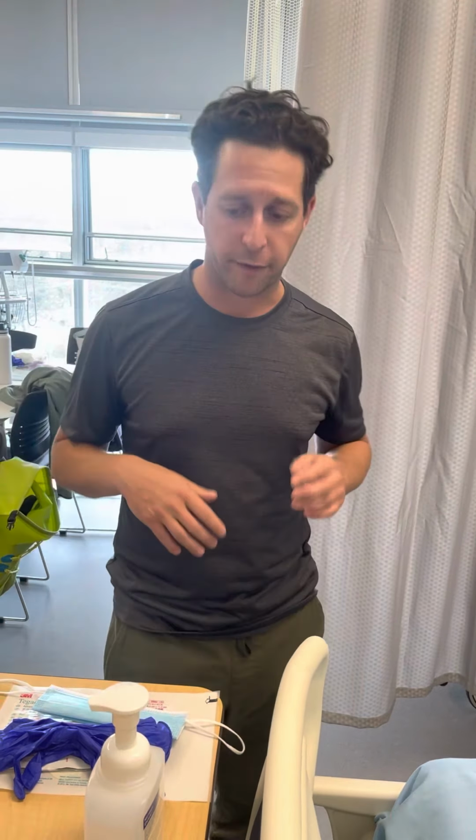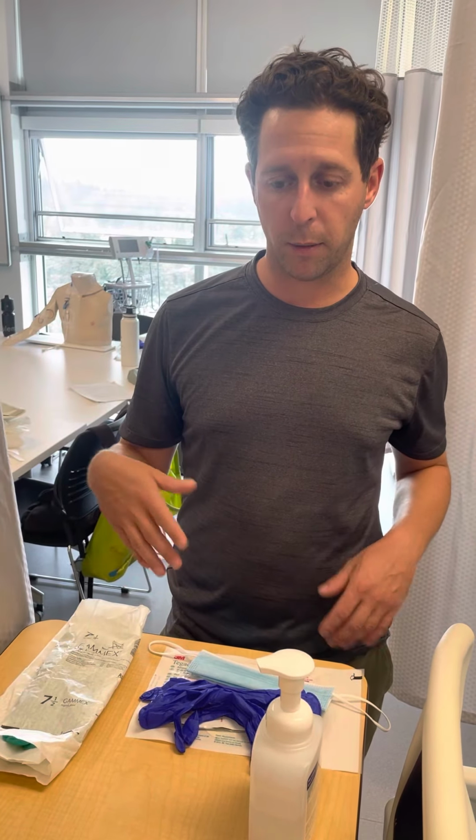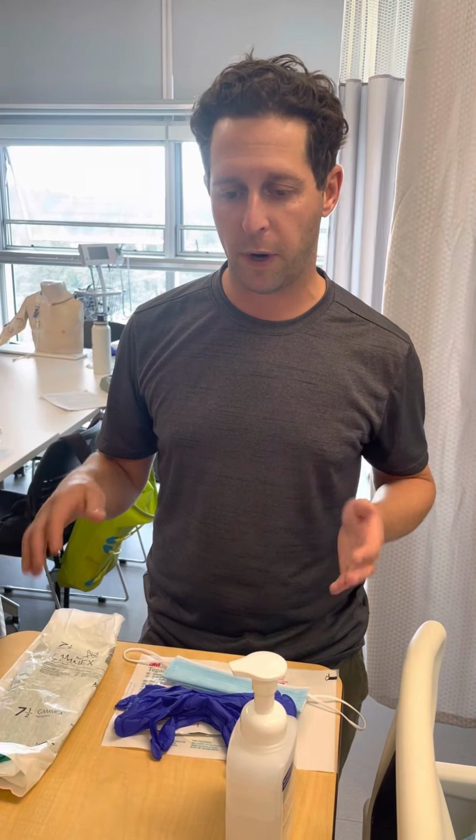I've gathered things that I'm going to look for at the bedside during my assessment that I won't say out loud: catheter damage, occlusion, infection, infiltration, migration, sepsis, skin erosion, extravasation, and emboli. I've gathered all my materials. I've wiped down the tray and the table that I'll be using, and I let it dry before I put everything on it.